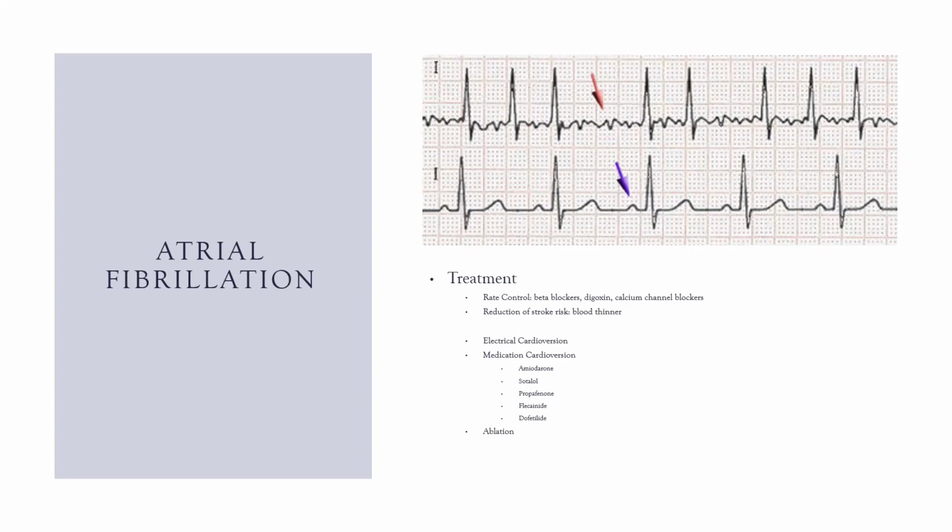If our patient becomes unstable, and what I mean by unstable, they all of a sudden have pallor, cyanosis, they're not mentating, they're completely confused, or they completely pass out on you, we have to electrically intervene on atrial fibrillation. So one of the things we can do is electrical cardioversion. Electrical cardioversion, you attach the pads, you change the defibrillator machine to cardioversion. It syncs up with the QRSs and it learns how to shock the heart back into a relatively normal rhythm.